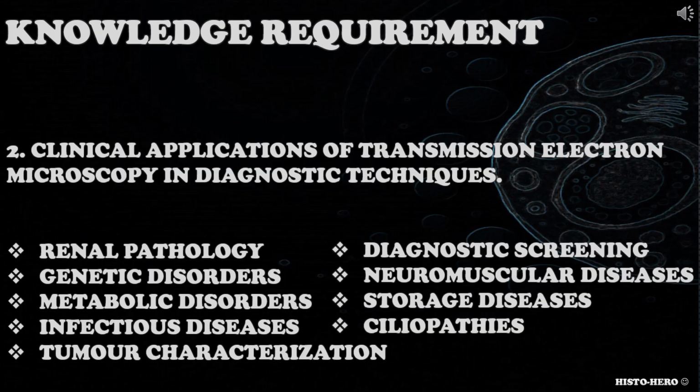When addressing this knowledge requirement, candidates should consider application of TEM as diagnostic technique, kidney diseases like podocytopathies or glomerulonephritis, neuromuscular disorders, tumors of poor differentiation, ciliary abnormalities, infectious disease by visualizing viruses and microorganisms, metabolic and storage diseases.